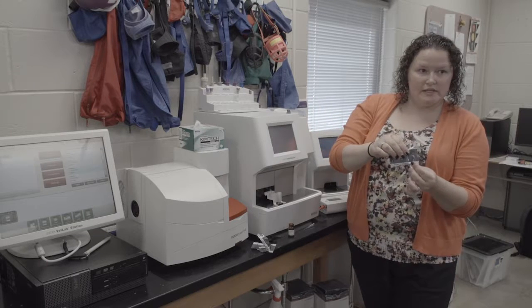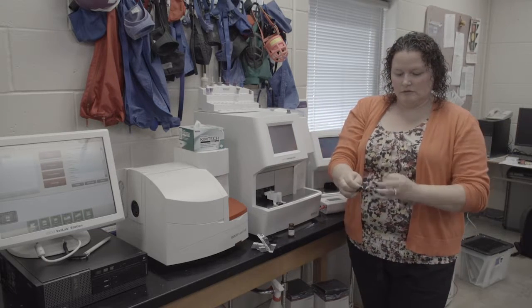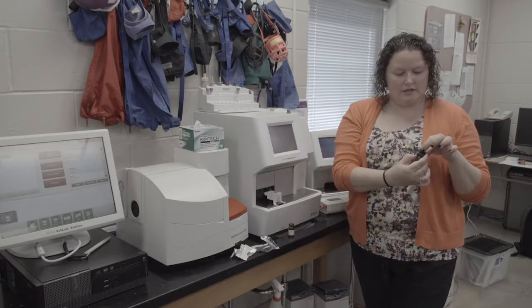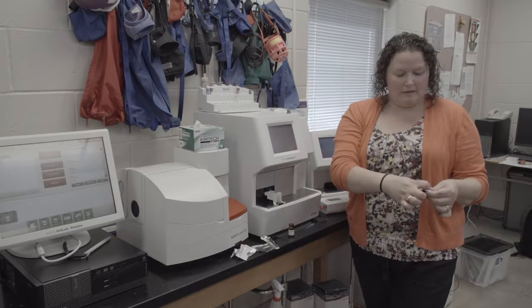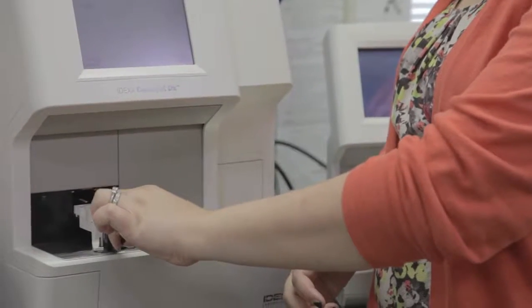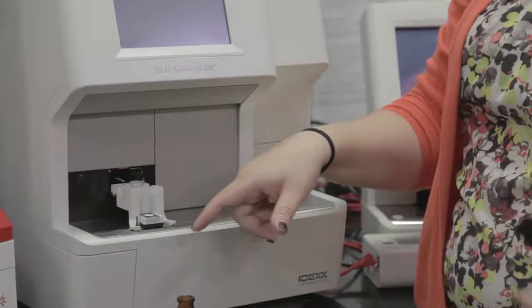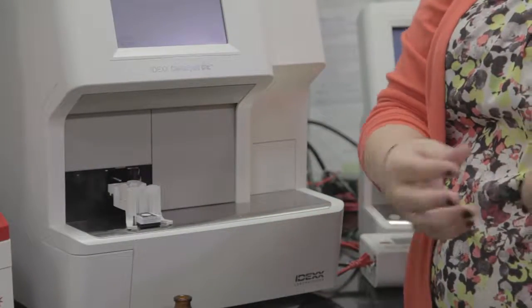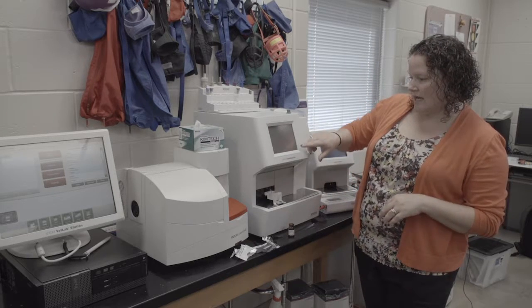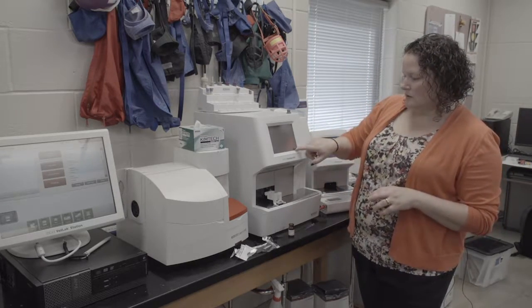Then I'm going to take my QC clip and I'm going to put that right over the top. Same thing. I can touch it anywhere. I want the IDEXX up. I'm going to pop out the handle, hang on to that, start from the top, slide straight down, pull straight back. These are cut too so that you cannot put them on upside down. So keep that in mind. So I have my sample, I have my slides. I'm now going to tap on run.